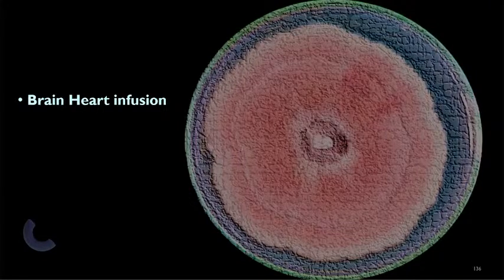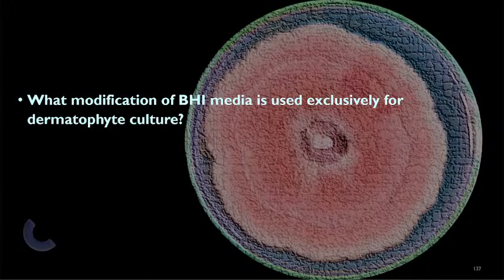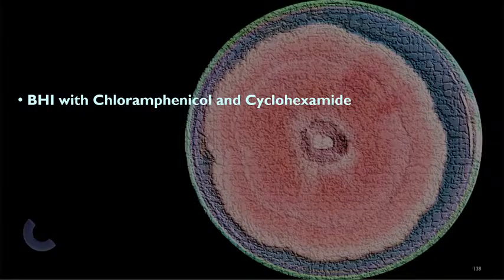But there are nutrients present in this particular infusion that makes it a suitable environment for a fungus. Okay, now. Modification of BHI, exclusively used for dermatophyte culture, is again BHI with chloramphenicol and cyclohexamide. Okay? So, lagi nyo lang tatandaan, chloramphenicol and cyclohexamide.